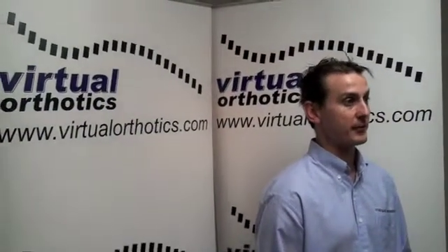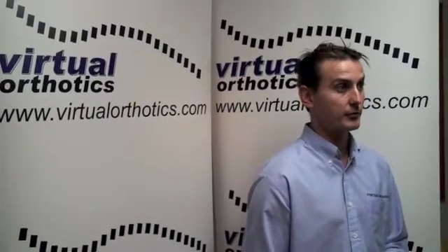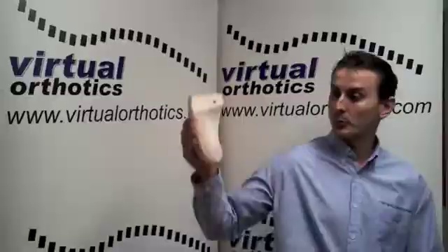Traditionally, podiatrists would take a negative cast of the patient's foot for manufacturing of foot orthoses. The negative cast would then be sent to the orthotic laboratory, and from that negative cast, the laboratory would make a positive model. From this cast, a piece of polypropylene or plastic would get vacuum pressed across the top of the cast, so you'd actually have the contour of the orthotic based on this shape here. From this shape, the laboratory would then grind the orthotic and send it back to the podiatrist for fitting to the patient.